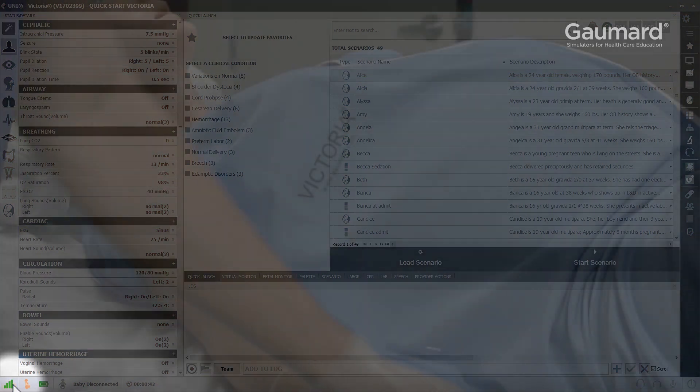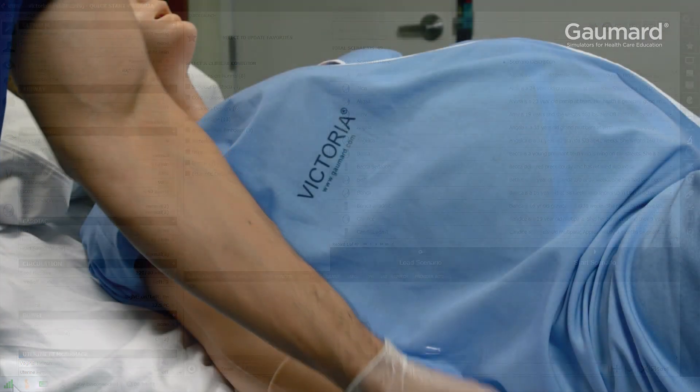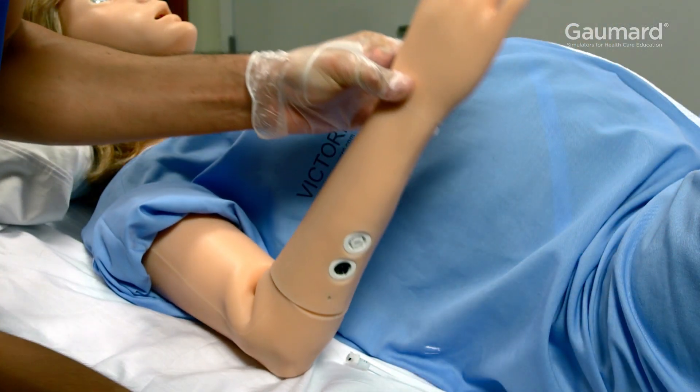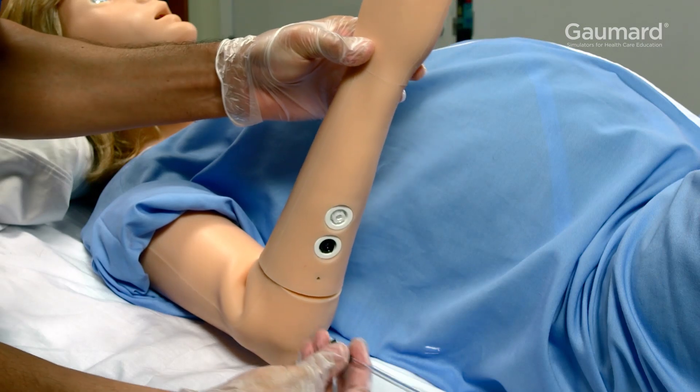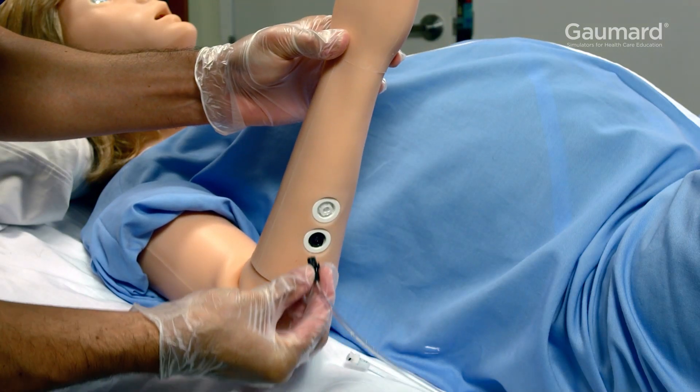Once the simulator is on, you will need to prime the arm before the automatic drug recognition is ready for scenarios.